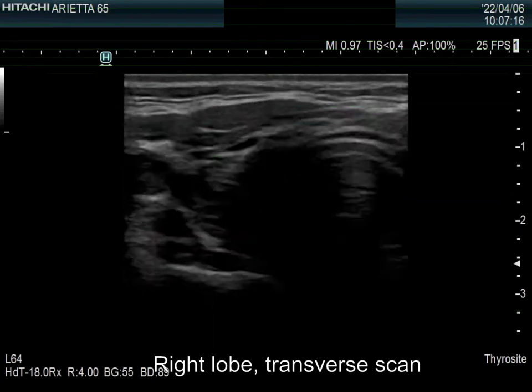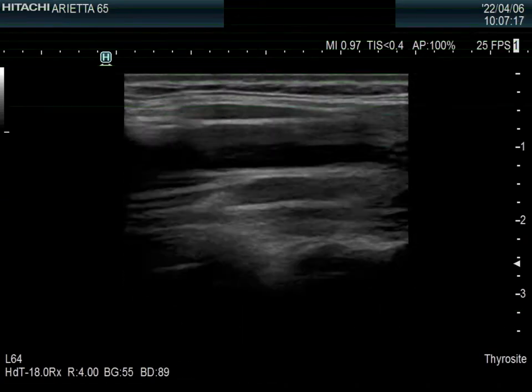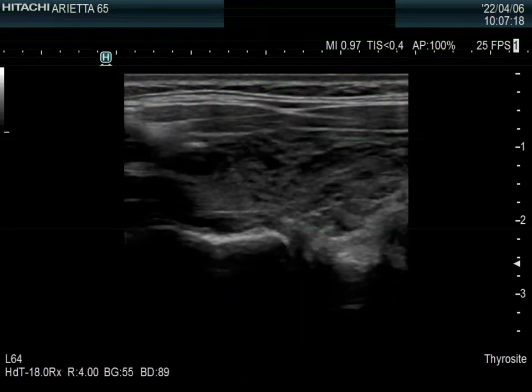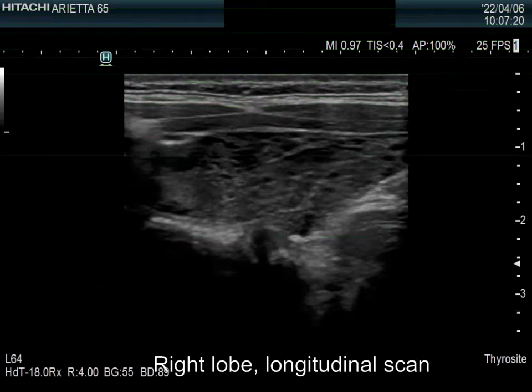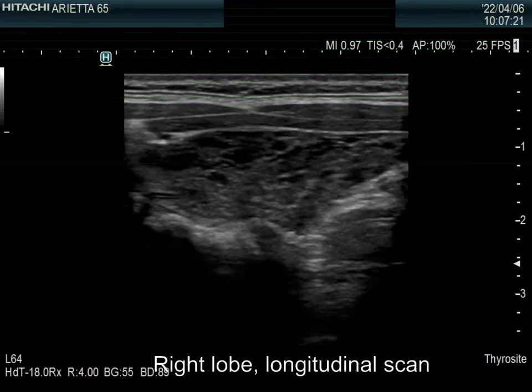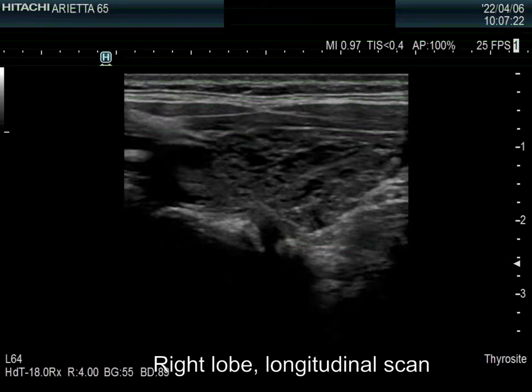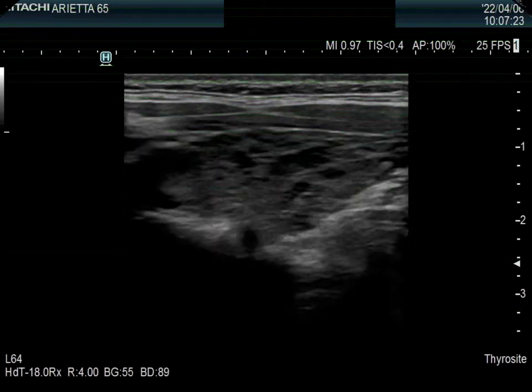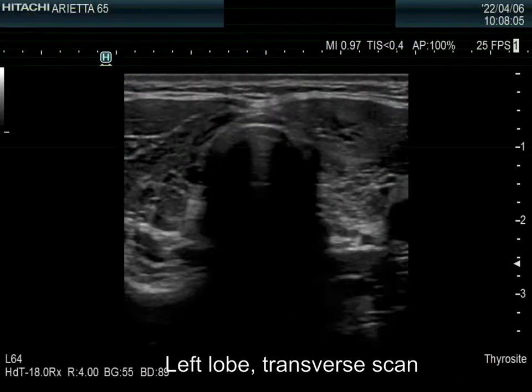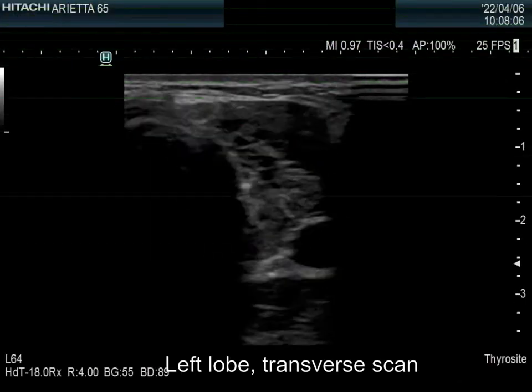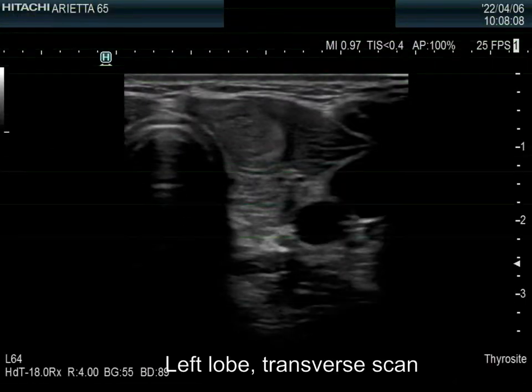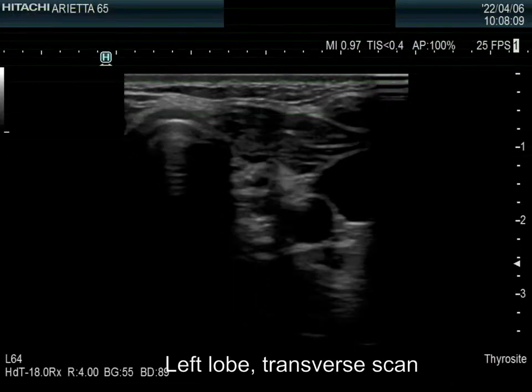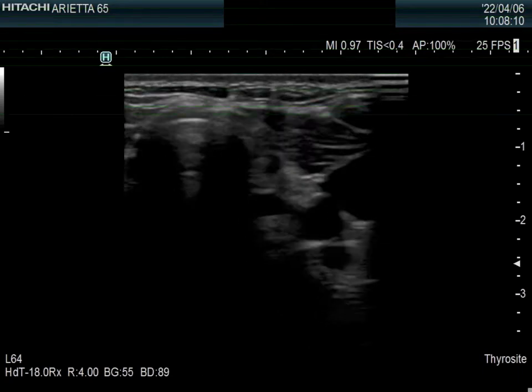The right lobe is moderately hypoechoic and has numerous more and less hypoechoic discrete lesions; none of them corresponds to a pathological nodule. The left lobe has a similar appearance.